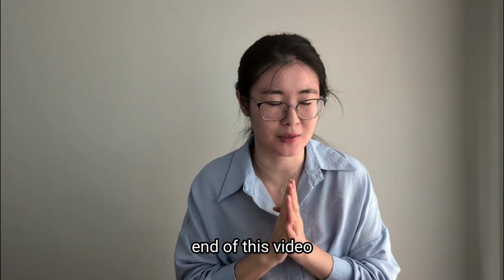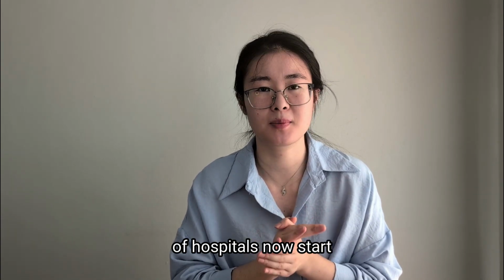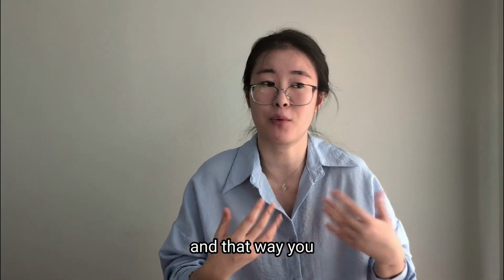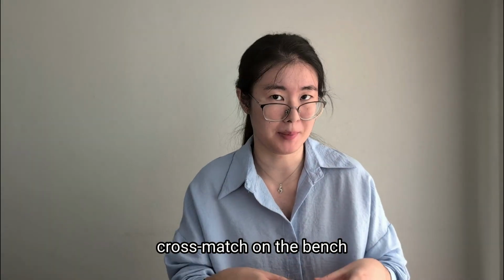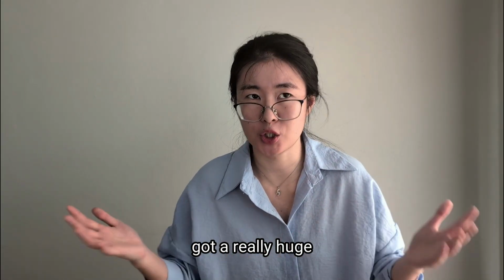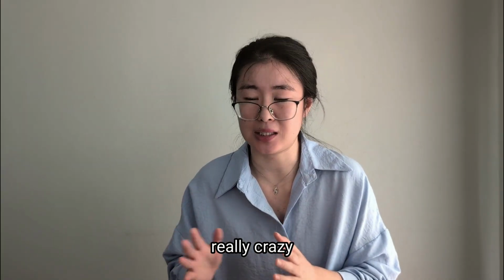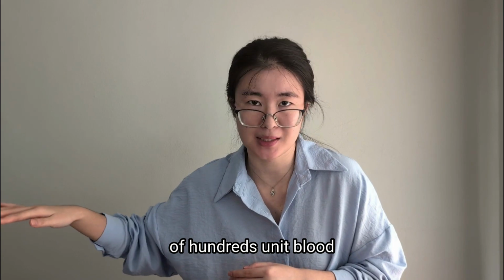And at the very end of this video, let's talk about the electronic cross-match. I know a lot of hospitals now start to do that, and the goal for that is primarily, 1, to increase the speed of cross-match, so you can get your blood products a little faster than when we do manual cross-match on the bench. 2 is actually for easier inventory management, because especially if you have a really huge blood bank department in a hospital, the inventory can be really crazy. You will have shelves of hundreds of units of blood sitting in there.